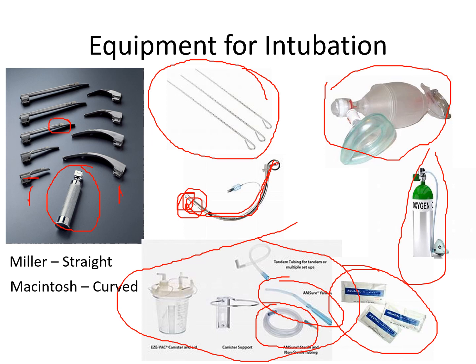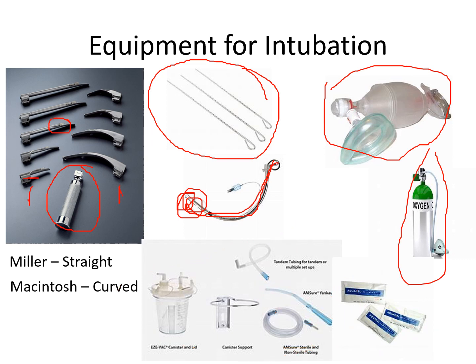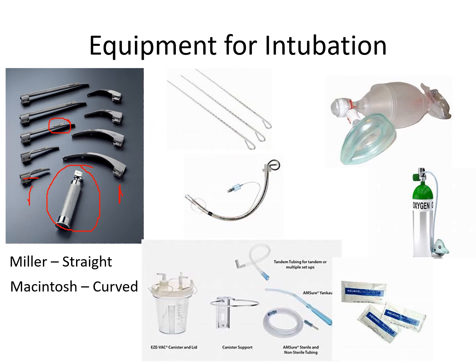And just know where the location of your equipment is in your institute or even department. Also note whether there's a respiratory box versus a crash cart. Some places will have a separate intubation box. Others will have the intubation equipment directly in the crash cart. So it is important for you to know where exactly the intubation equipment is and have that ready for the provider, whoever is going to be performing the intubation.